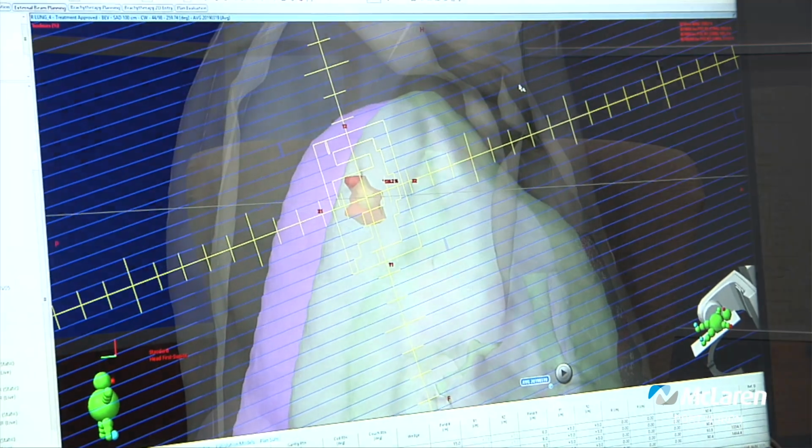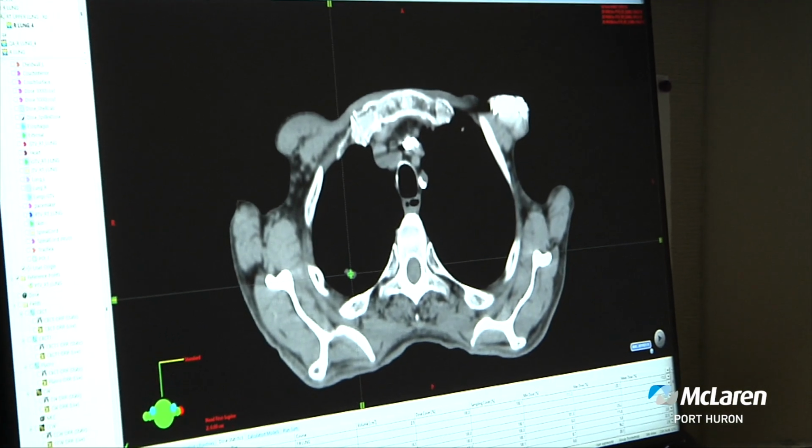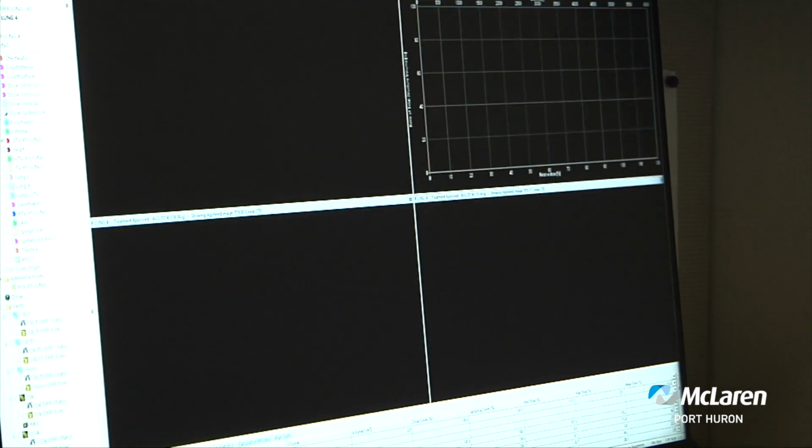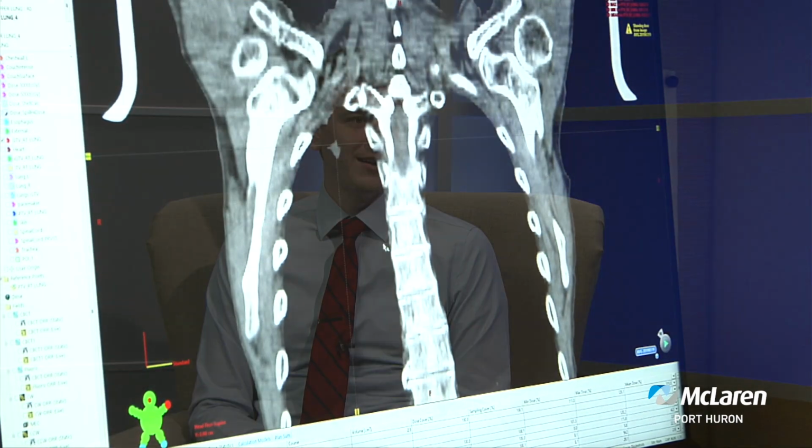We've talked about in other segments how the care for radiation therapy is very individualized. You talked a little bit about how you put it all together. Can you expand on that? Yeah, we bring in a lot of different imaging studies that they have done prior, and when we take our CT simulation, we fuse them together. So when the doctor pulls it up on the screen, they can toggle between the CT simulation and, say, the PET scan and see exactly where the tumor is. One of my responsibilities is making sure that fusion is accurate, because the inside of a body is never the same day to day. There are going to be little discrepancies, and we have to make sure that the area we're interested in looks accurate.